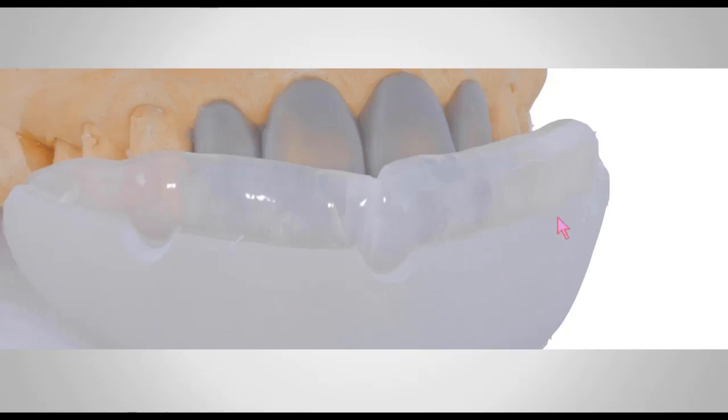And here's my clear triad. The one that I have used right now is Reveal. This is the one that you're seeing inside my clear triad. What I did is I literally injected the clear PVS into the clear triad, and then with my hands I seated the clear triad with the clear PVS inside onto the wax up.